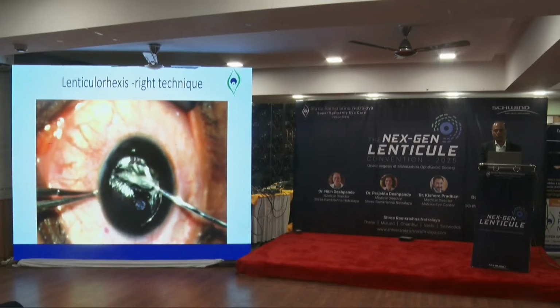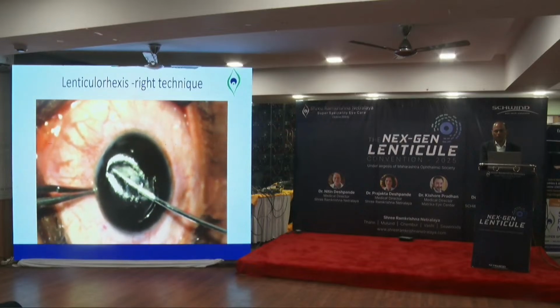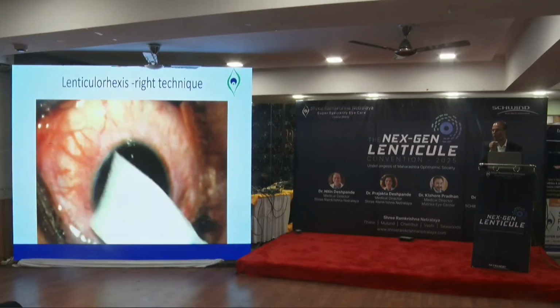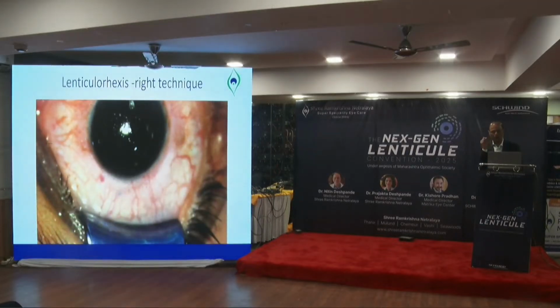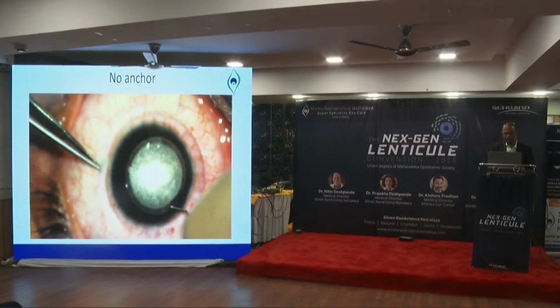Yeah, but now again you are still away from the edge. You should not do this. You will tear it. What I should have done is gone back to the edge and now it's out. So if you don't go to the edge and peel circumferentially, and if you just try to pull in the center, that's not the right thing to do. And again, one more video.